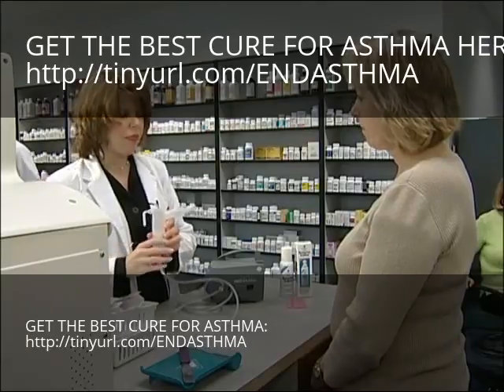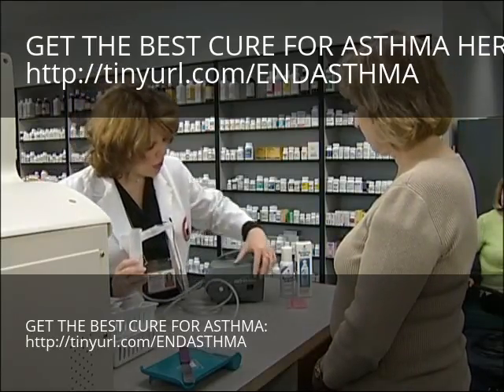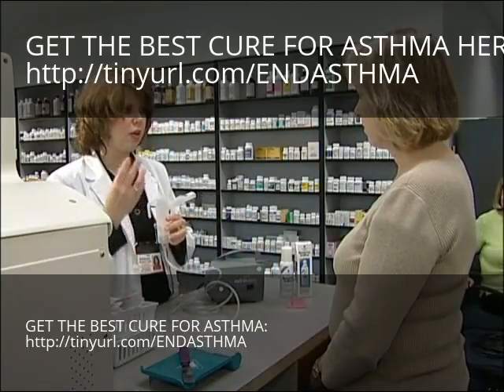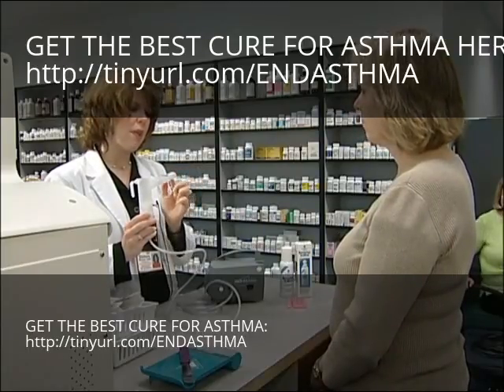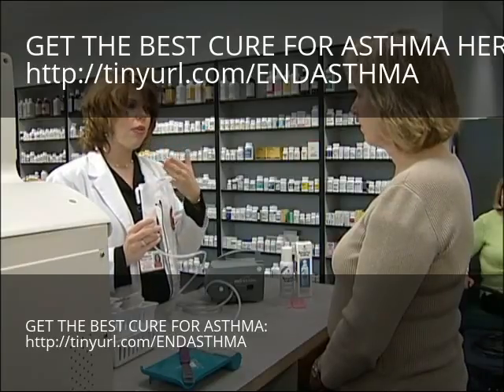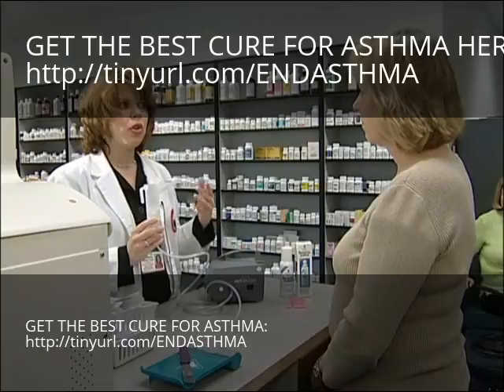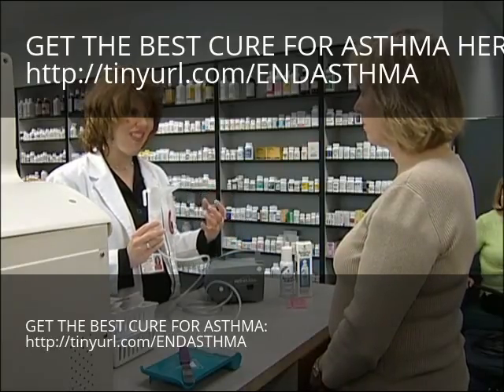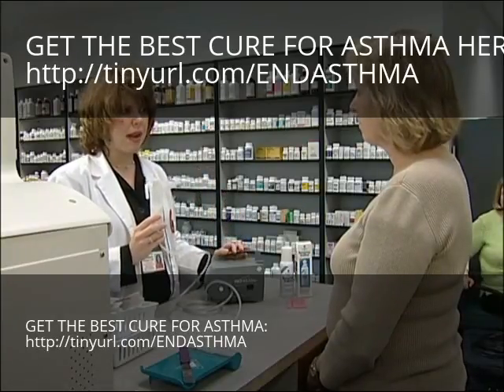Once you've done that, your nebulizer is ready to use. You just turn it on and the air compressor will bubble air through the medication. You're going to put your lips around the mouthpiece — place it on top of the tongue and wrap your lips around it. Breathe in and out through your mouth as normal. Continue until there's no medication left to deliver or when it starts sputtering — that tells you it's out of medication, and then you can stop the medication delivery.